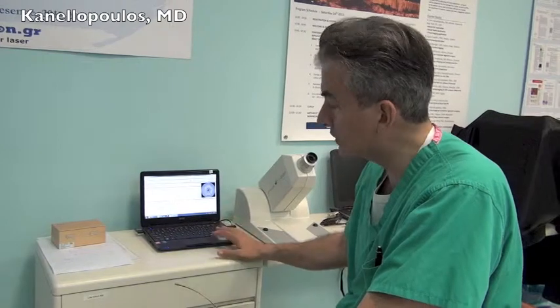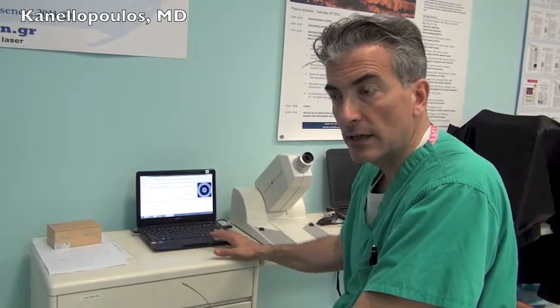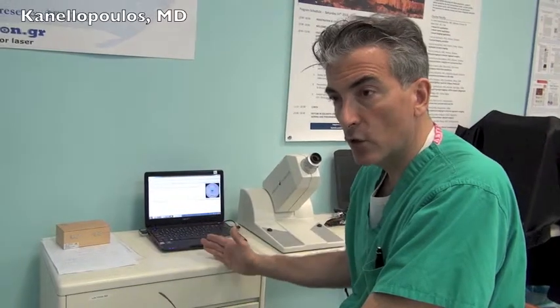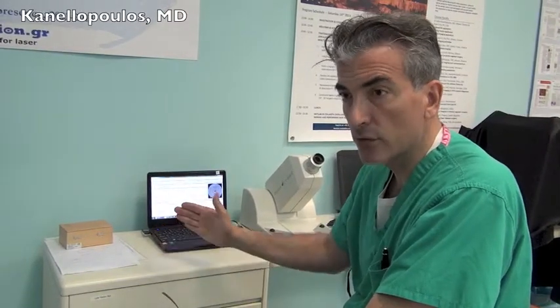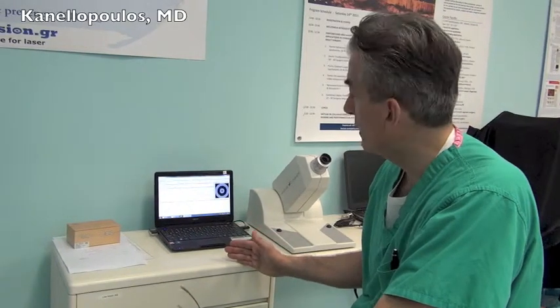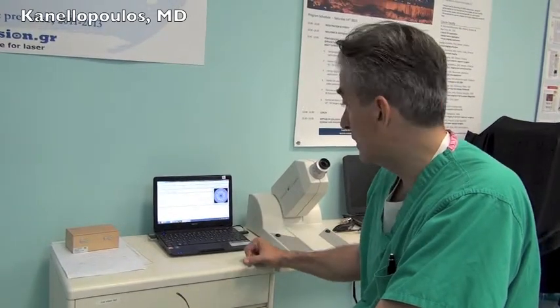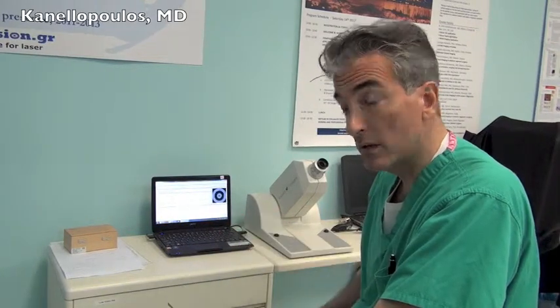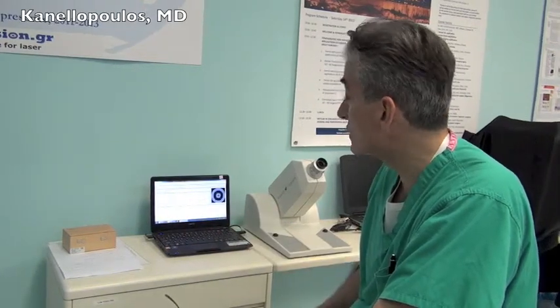We have found great facility with this device in getting a better idea in post-refractive surgery patients, correlating epithelial maps obtained with OCT, cornea irregularities obtained either with Scheimpflug, Placido imaging, or the new Cassini device, and finally trying to see if ocular scatter has something to do with degradation of the patient's quality of vision, if that occurs.